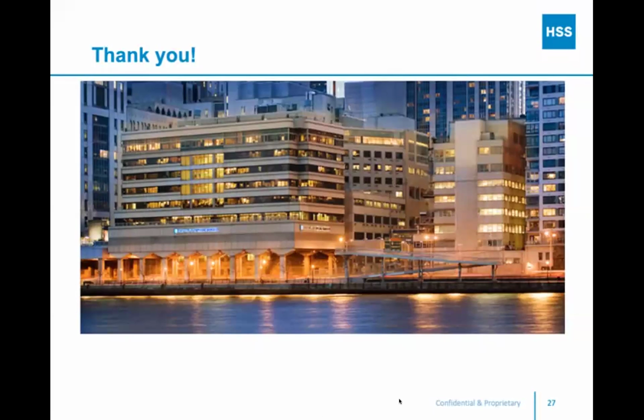Thanks, Stephen. That was a great presentation. I really appreciate when folks go through a protocol and have it be an intentional protocol, right? Not just jumping around and scanning a couple of things here and there. Your protocol-based evaluation of the lateral knee should give you a chance to confirm your diagnosis, rule out your differential diagnosis, and then assess for other things which may be a little bit unusual.